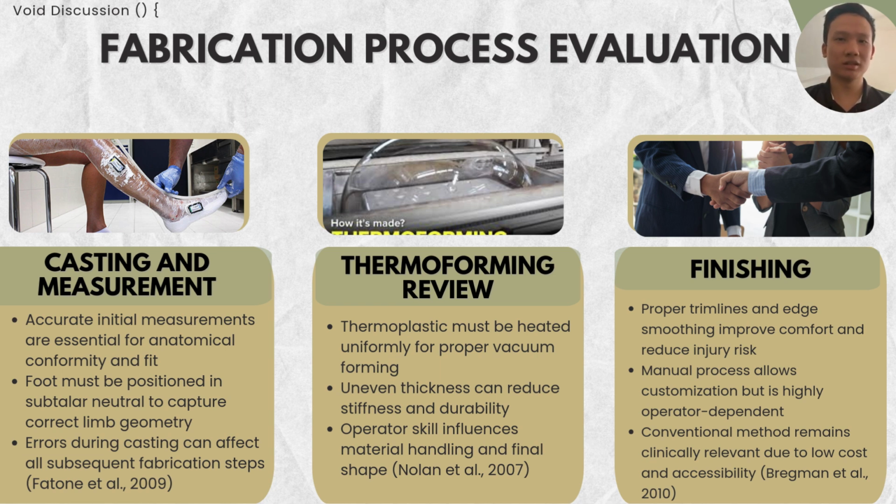And lastly, the finishing also plays a key role in comfort, as a proper trim line and smooth edges will reduce the pressure and the injury risk. Overall, although this conventional method depends heavily on operator skill, it is still widely used in the market because it has low cost, is customizable, and has clinically relevant properties.